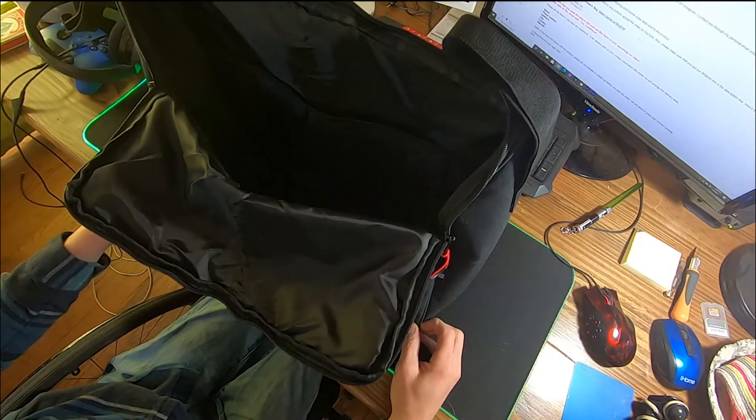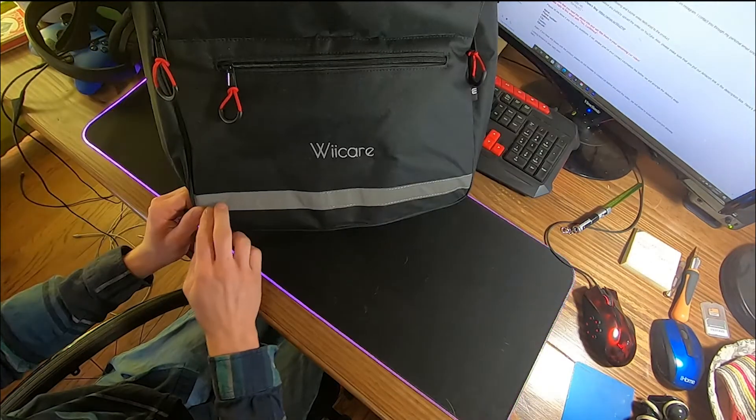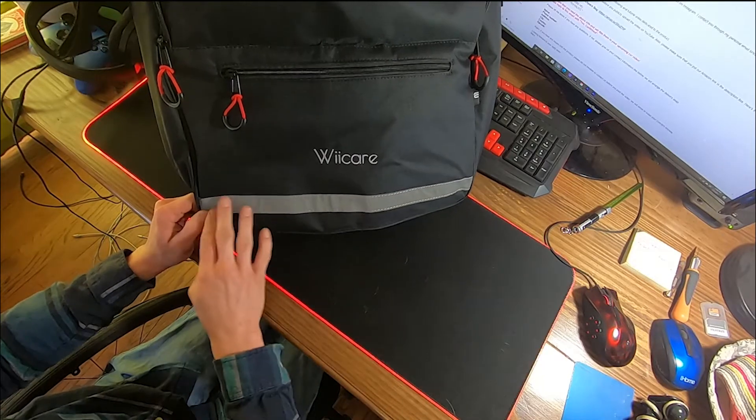I've actually really enjoyed using this backpack. I took everything out of it for this video so the pockets would be easier to see. It has a reflective strip across the bottom — since it's on the back of your chair, a light will hit it and reflect.